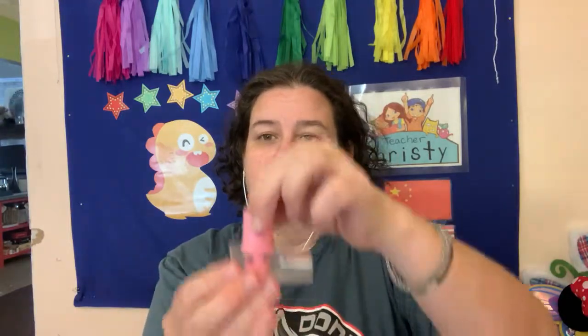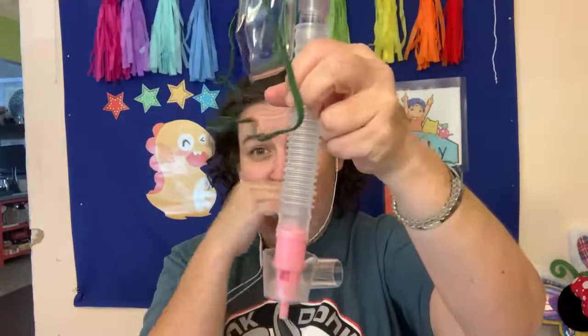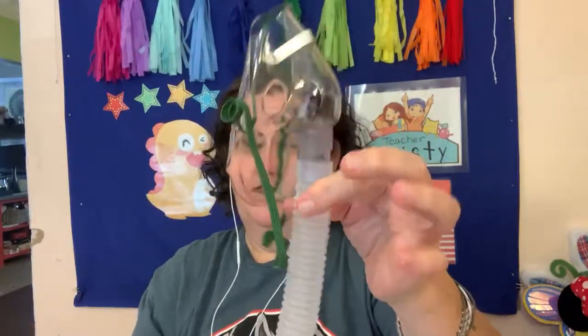Aerosol mask. Corrugated tubing. You attach your corrugated tubing to the aerosol mask. And now the parts that deliver the oxygen are going to go inside your cup area, the Venturi cup. So this sits in here like this, and then this attaches to the devices. So the Venturi mask, also known as a Venti mask, V-E-N-T-I, like Venti coffee. It stands for Venturi.